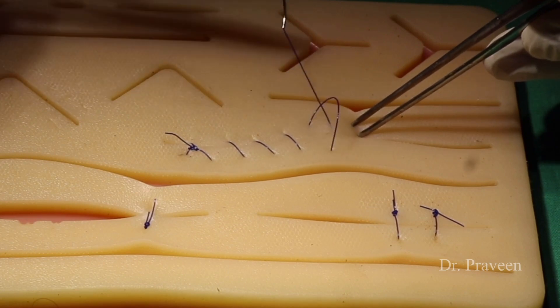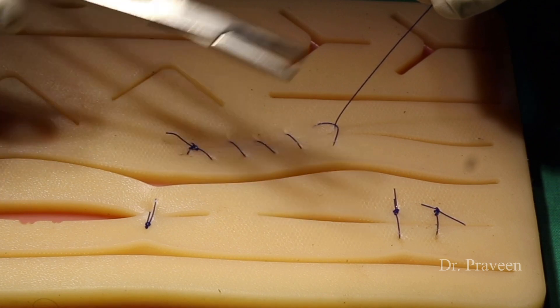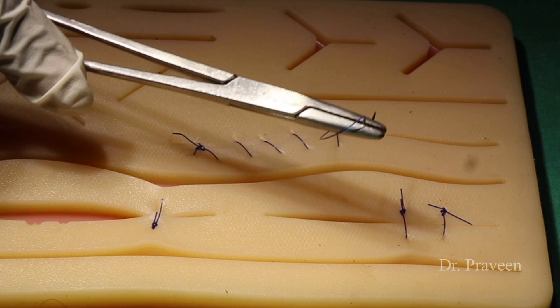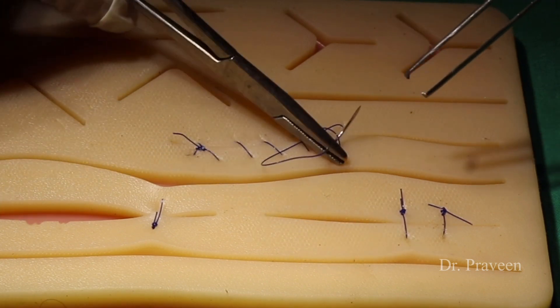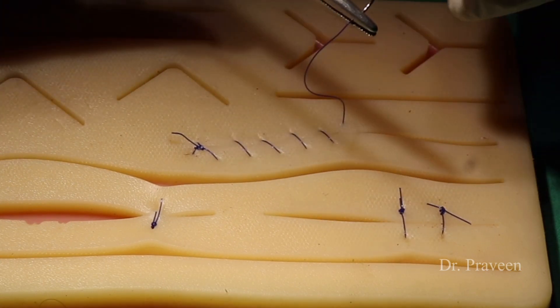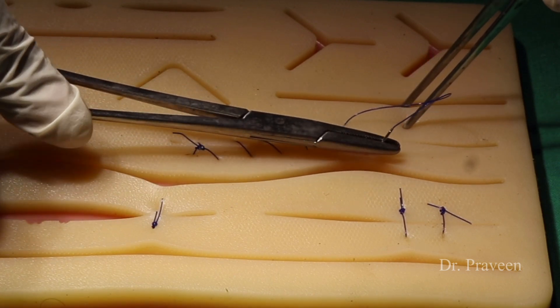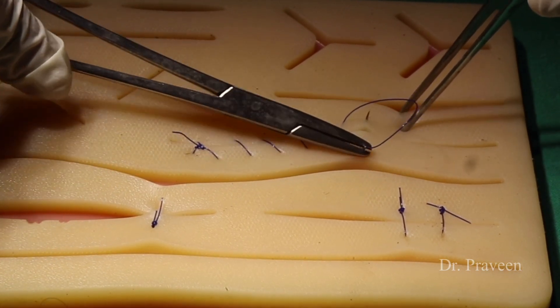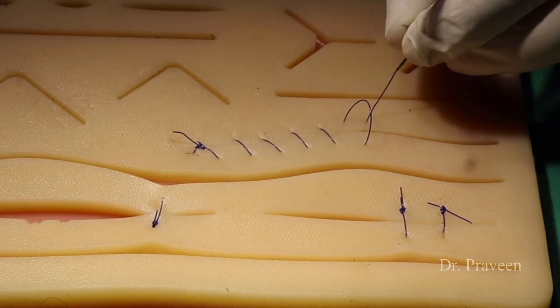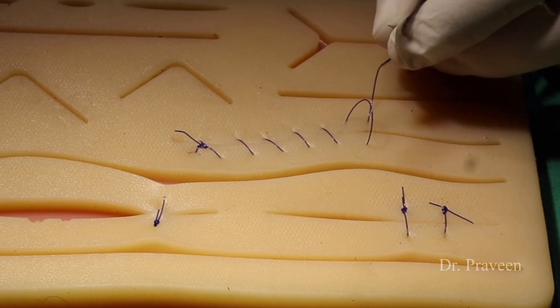This is the locking method. If you lock for each and every suture, it is called continuous locking suturing. At the end, you have to take two clockwise loops over the forcep and one anticlockwise loop to secure the final knot.